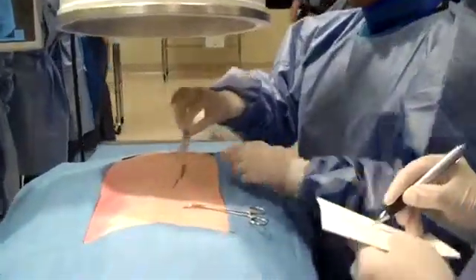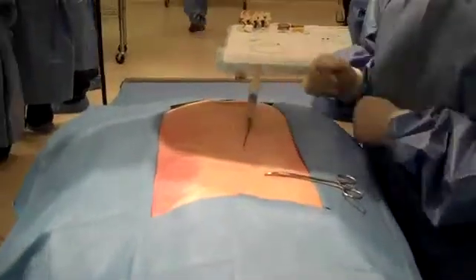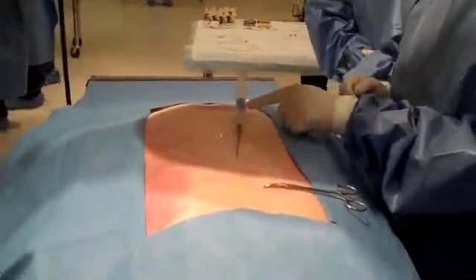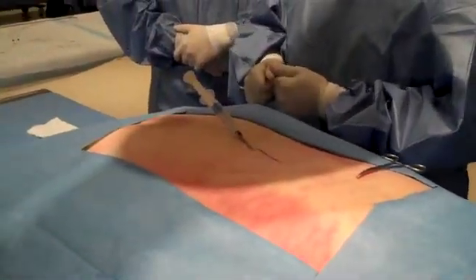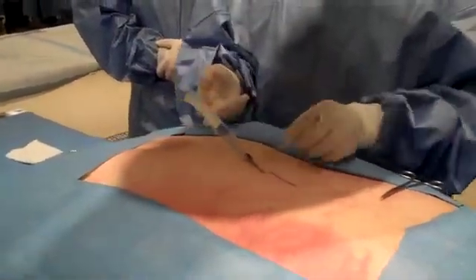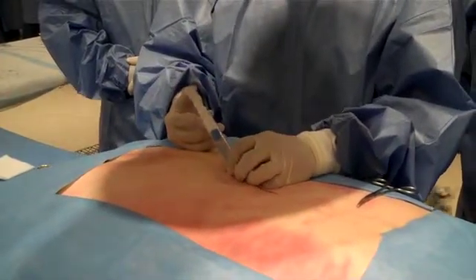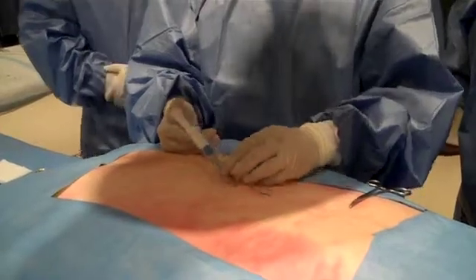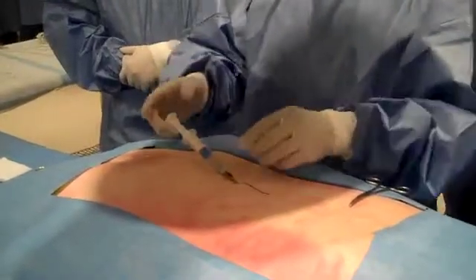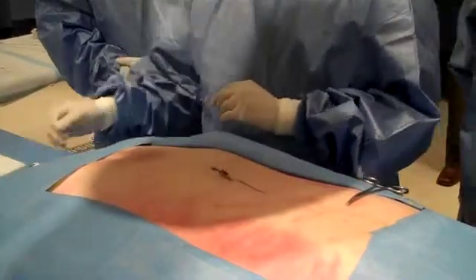Here we go. I use loss of resistance to saline and air. What ends up happening as a result of that is that not only do you get a tactile feel, but you also get a visual confirmation of that. Watch this — pressure, pressure, pressure. You guys can actually see the saline going down over there too. So we're in space — we're in the actual epidural space now.